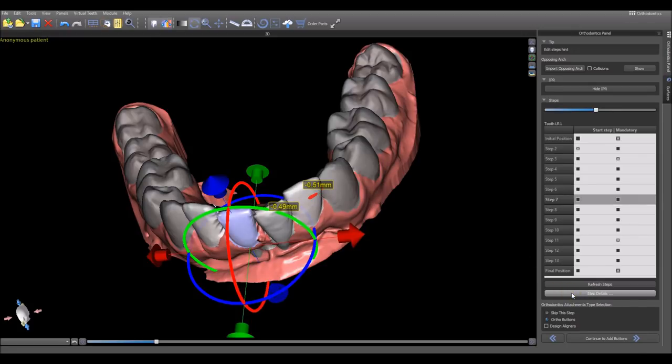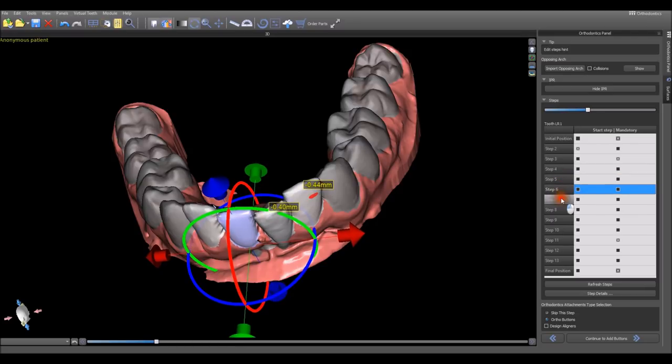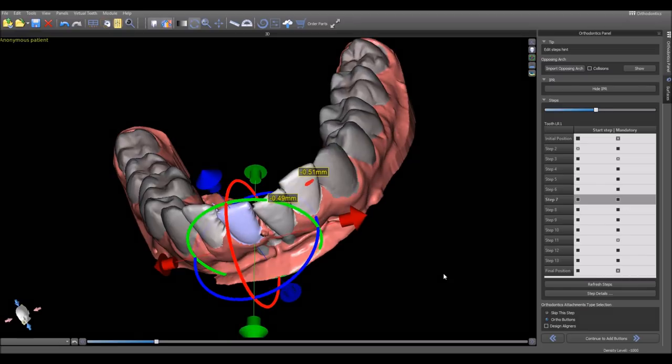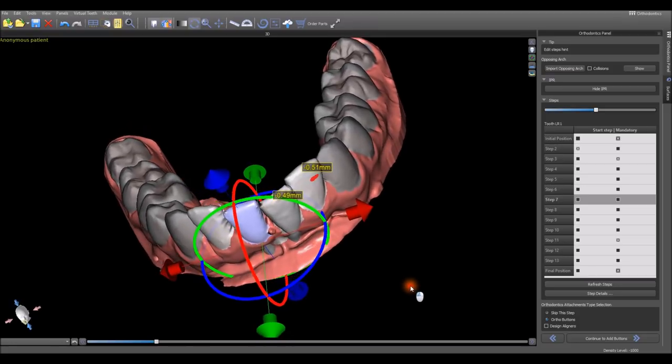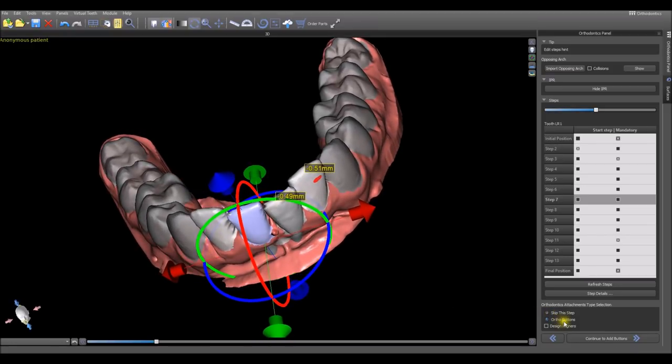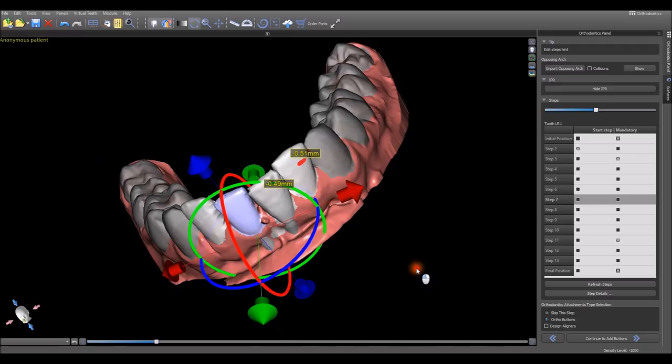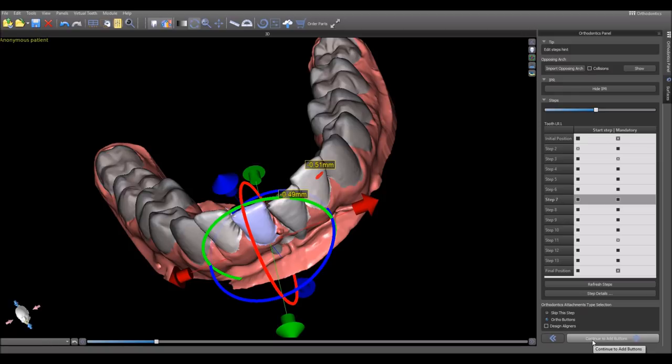The step details button will show us for any given step that we click on what the tooth movement is for each of the relevant teeth. We can now indicate to the software if we're going to be adding button attachments to the case and if we're going to be designing aligners directly in the software. Currently, I don't believe there's printing material that can be used to print aligners directly, but we're getting closer. We're going to click ortho buttons and continue to add buttons.